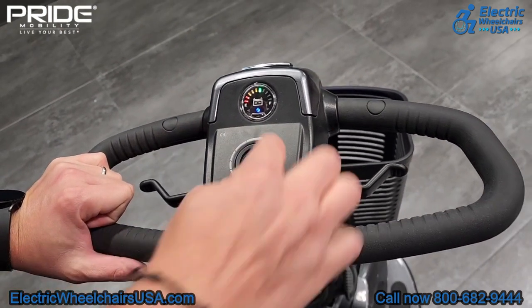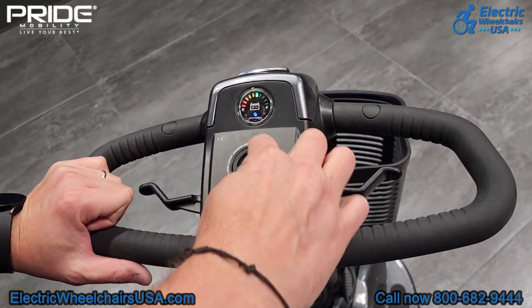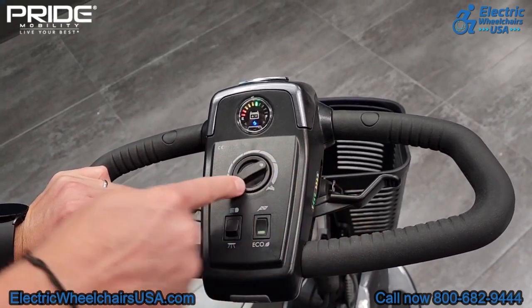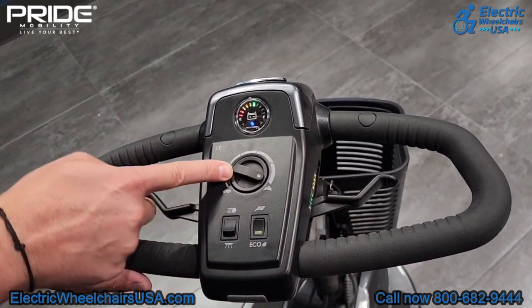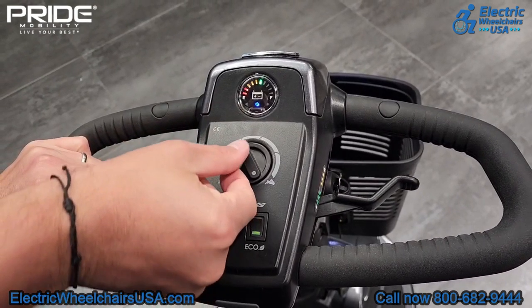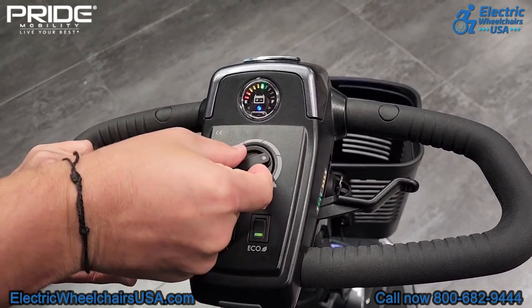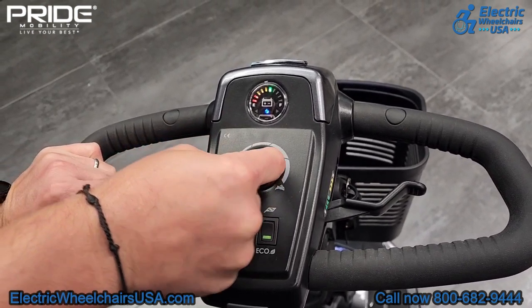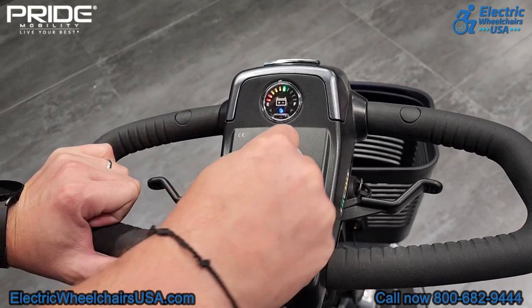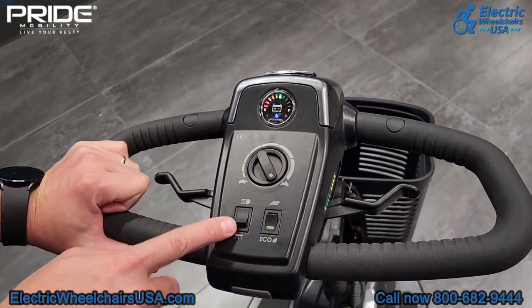This is your speed control dial. If you turn it all the way to the right towards the rabbit, you can reach your top speed, which is a little over 5 miles per hour. However, if you turn the speed control dial all the way to the left towards the tortoise, that would decrease your top speed to about 2.5 miles per hour. So it might be a good idea to turn it down if you're riding in a store or you're riding around crowds of people.